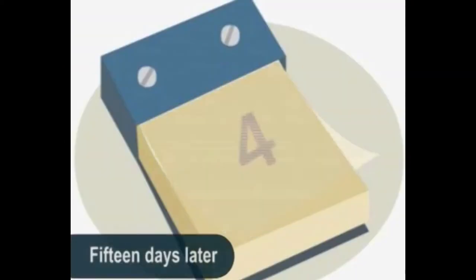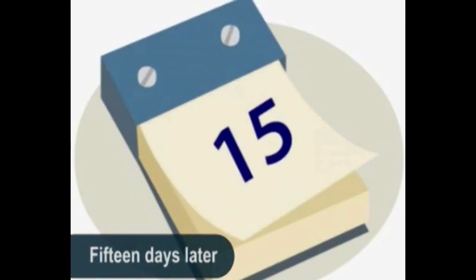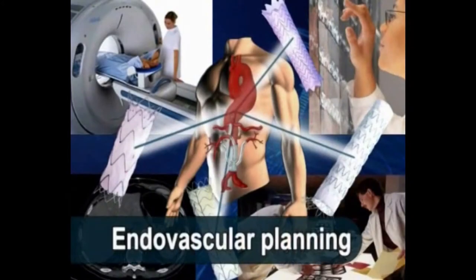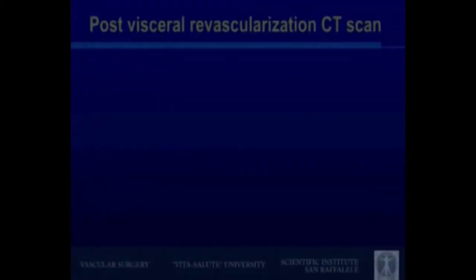In the second stage, a CT scan was obtained to check the adequate patency of the visceral vessel rerouting and to plan the stent graft implantation.